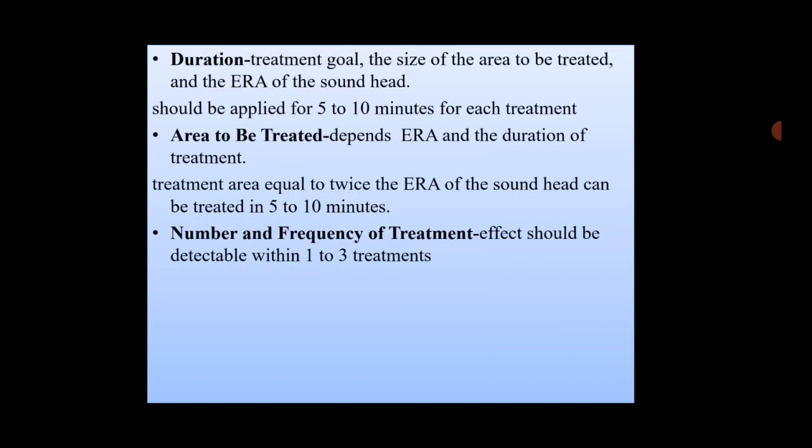Number and frequency of treatment. Effect should be detectable within 1 to 3 treatments. If the patient is not getting any improvement, then you have to change the parameters.